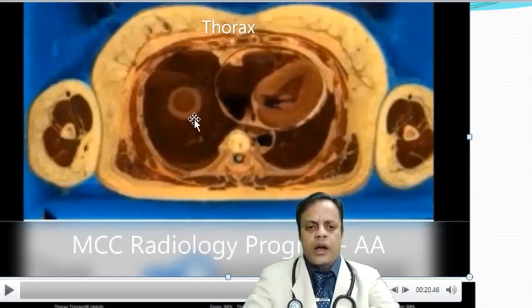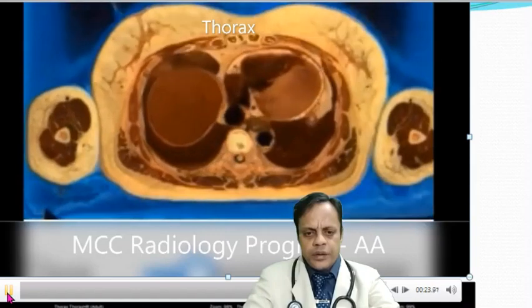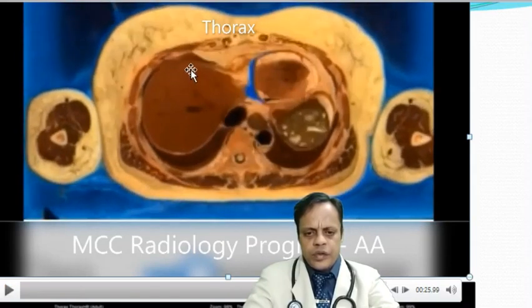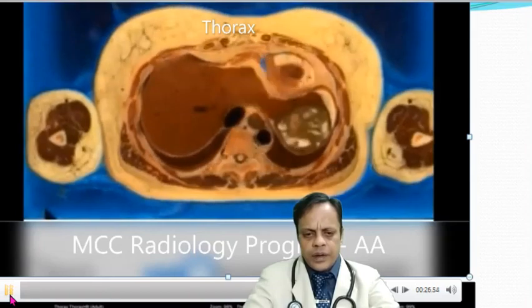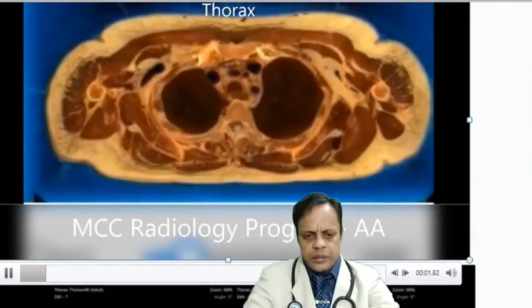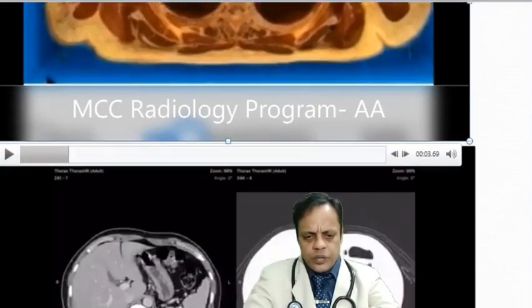We can see it earlier on the right side. You can see it emerging, and now we have reached the base. So this is the diaphragm, and the esophagus will open into the stomach, and a lot of things are there. Let us go superficially about it.